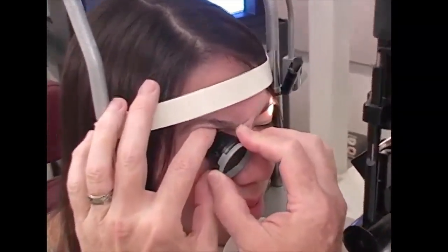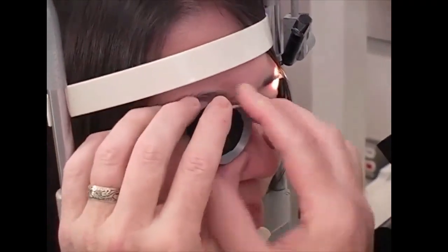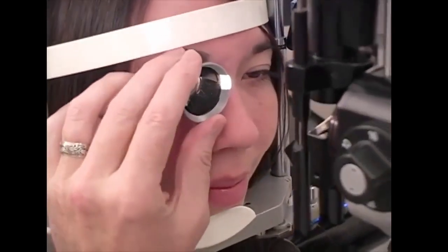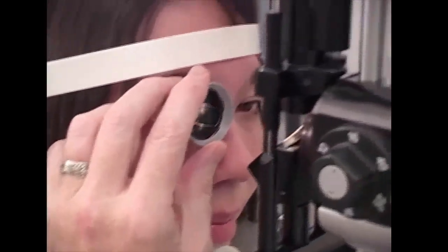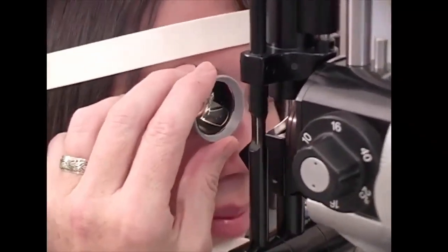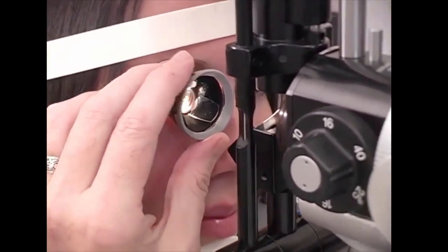She looks up. I put the lens in and rotate the top back. And then I try to hold this lens with 3 fingers so that I can rotate it without using my other hand. My other hand is obviously on the joystick of the slit lamp. But this holding with 3 fingers takes a little bit of practice, so don't worry if that's not easy to do at the beginning.